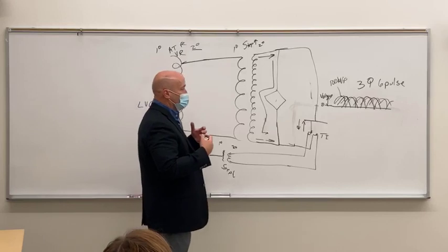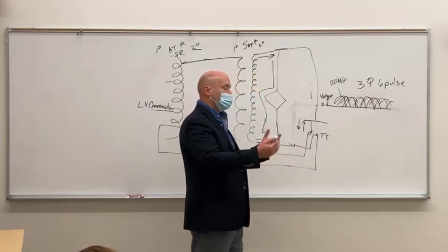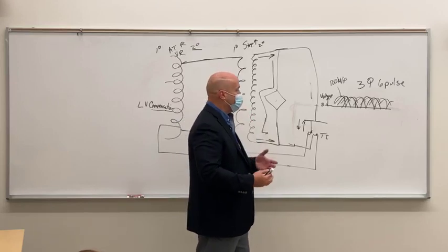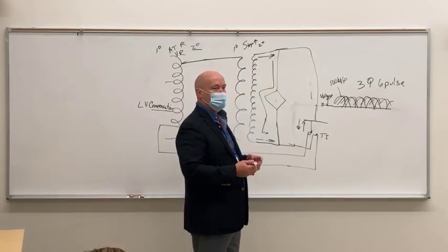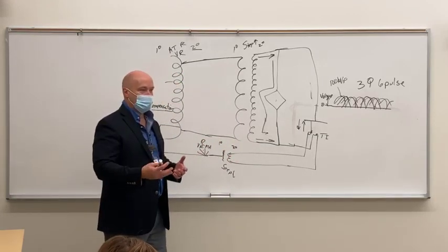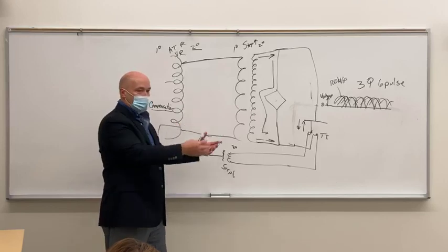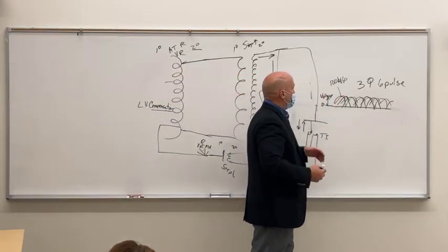And that was a step towards a more modern machine type. It took place probably late 70s, early 80s. It improved the output, increased the output of the X-ray machine by increasing the pulses. It also gave us a higher average voltage.